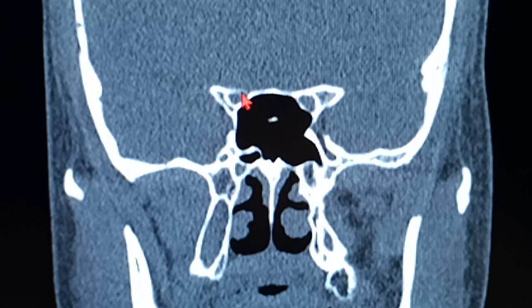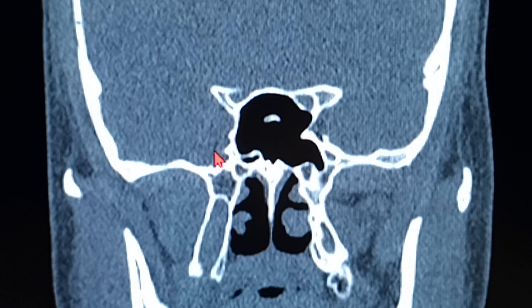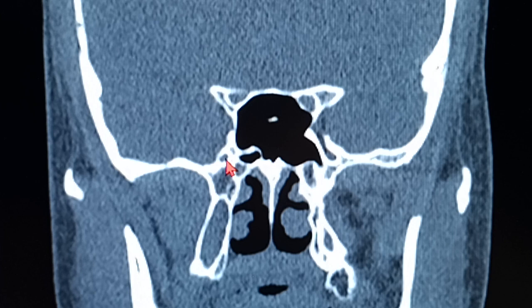You can see this is the soft tissue circle of foramen you can see over here. And you can see a canal over here. The same thing you can see over here and here. This is the canal here, and this is the canal over here. I think this is a slightly tilted scan. That is why it is not symmetrical on both sides. So yeah, you can see a canal structure over here, and you can see a canal structure over here.